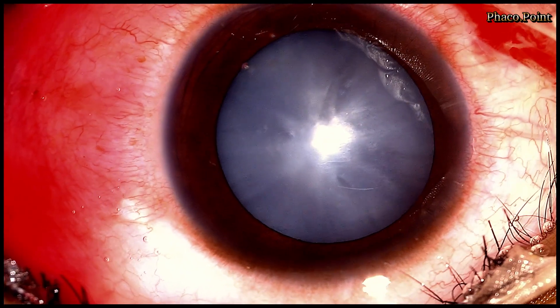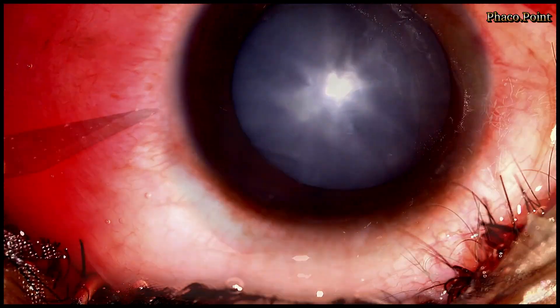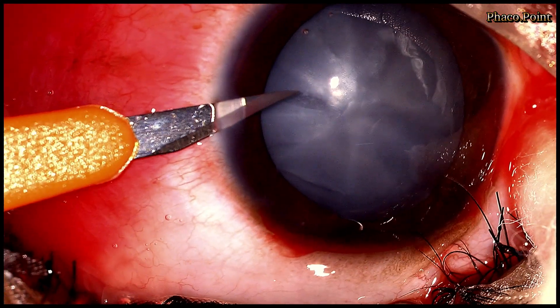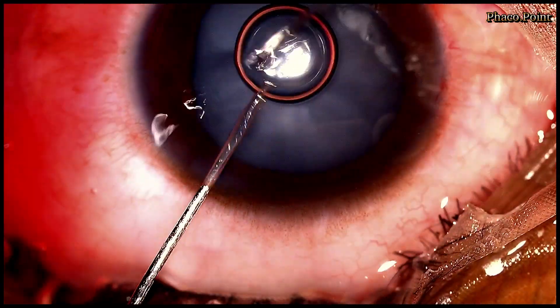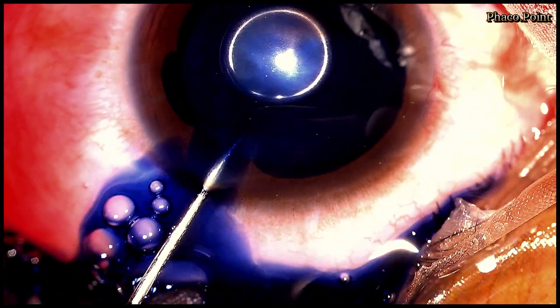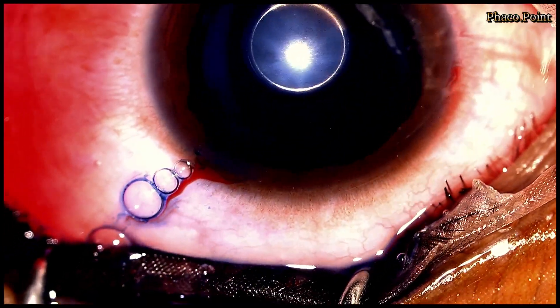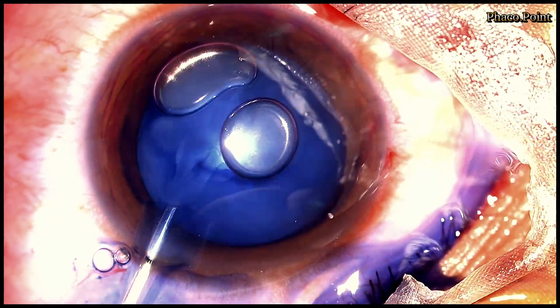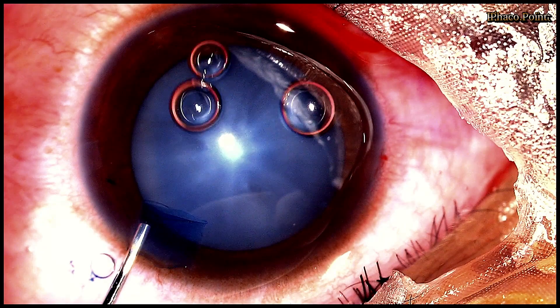We start the surgery with the meticulous construction of the incisions. When dealing with the total cataract, it's extremely important to take adequate time to stain the anterior capsule with blue dye to allow for adequate visibility during the creation of the rhexis. Limited visibility in a case like this itself could compromise the capsular rhexis.